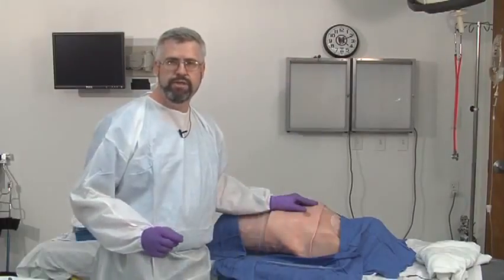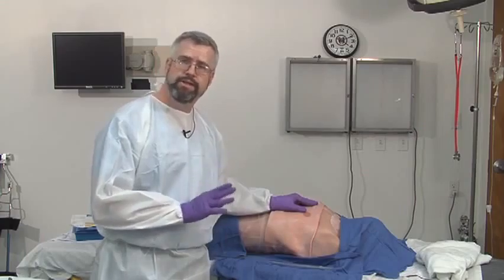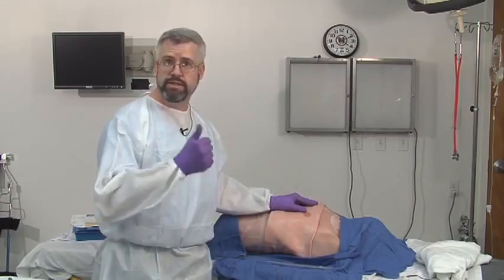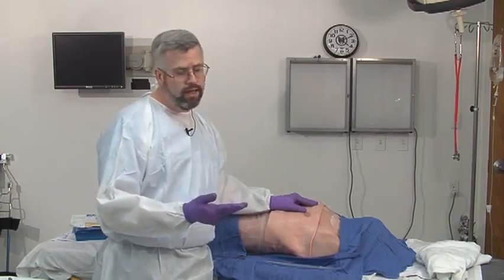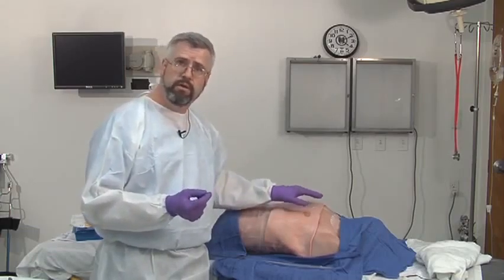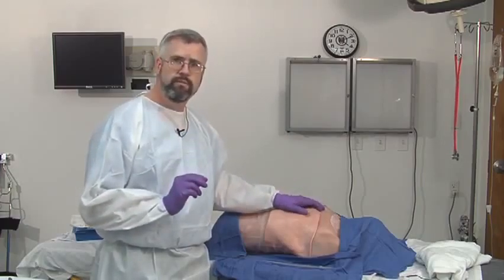The chest tube procedure is something that every physician needs to know how to master, because this is something that you can save a life with. In fact, 85% of all penetrating trauma to the chest and blunt trauma injuries can be treated with just a chest tube alone. Indications for a chest tube are such things as a simple pneumothorax, a tension pneumothorax, or a hemothorax. If you have a tension pneumothorax, you're going to precede the chest tube by putting in the needle thoracentesis, which we taught you earlier.